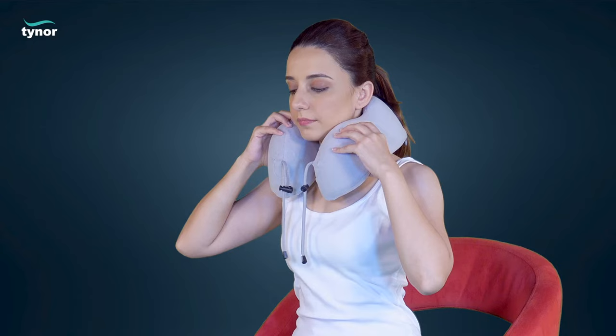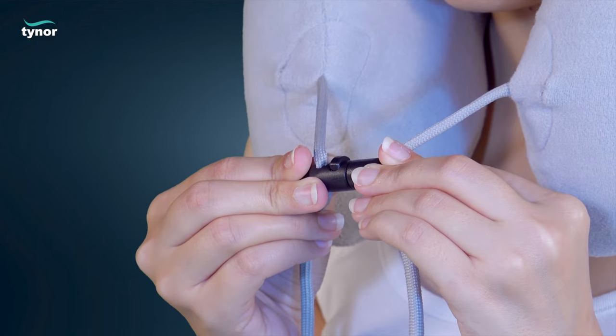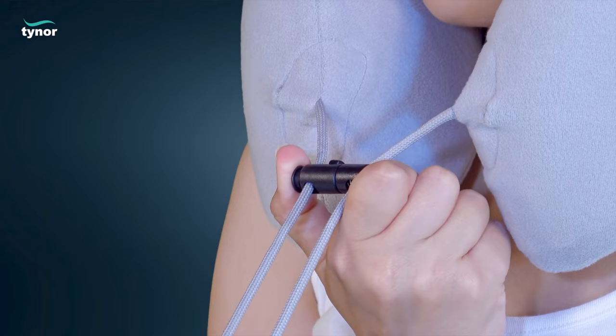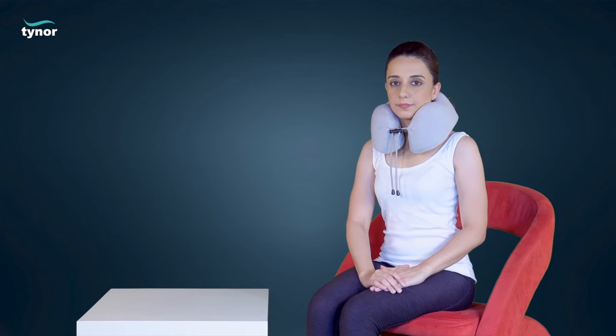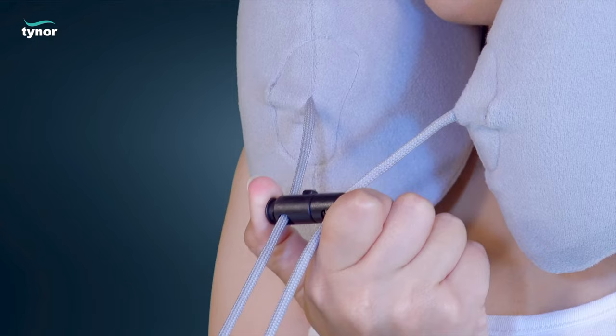Keeping the neck in neutral position, snap the closure assembly back in place. Press the locking button on both sides and pull the strings to tighten the pillow to a comfortable and snug support, then release to lock the strings.